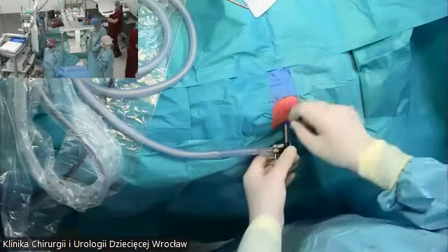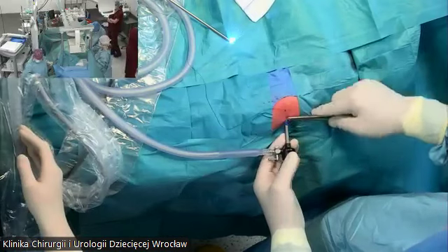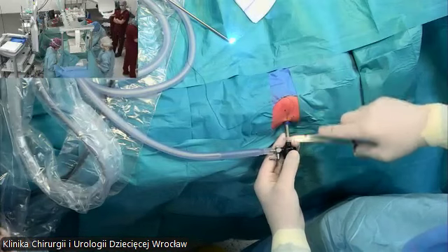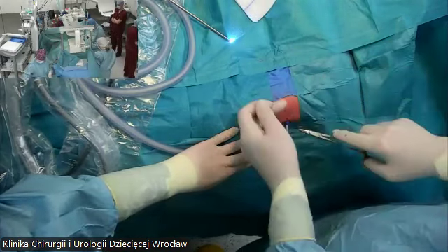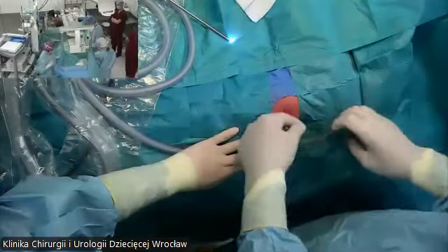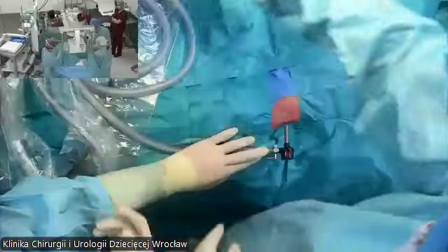Okay, can we secure it, Chef? So this is how we fix the trocar. There is nothing more frustrating than fighting with trocars that are going out and in. So it's very important to prepare everything. Usually when we start with the insufflation, there is some drop in saturation. But it's not true today because the baby has 100% saturation, so doing fine. In progress. Okay, let's go.